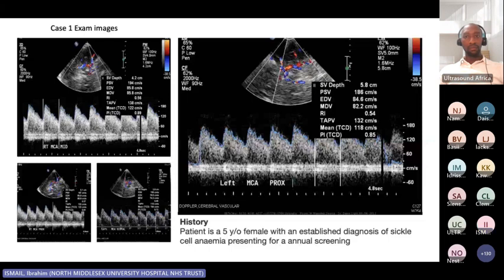Just looking at this image now, and not having the time average peak velocities, if you just look at the peak systolic velocity, it might look high. It looks quite elevated, but you can't tell the time average mean here. That's not clearly visible. So you focus on the time average mean and allow the software and the machine you're using to correctly estimate it.